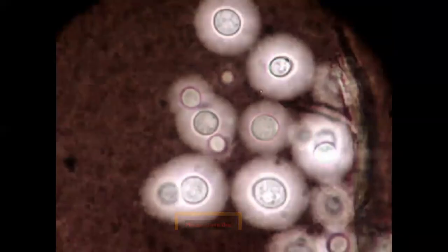See this. This is another India ink preparation. So, there are two types of budding fungi, two important budding fungi which you are going to deal with when you go to the clinics. One is Candida, another is Cryptococcus neoformans. Both cause infection in immunosuppressed patients.